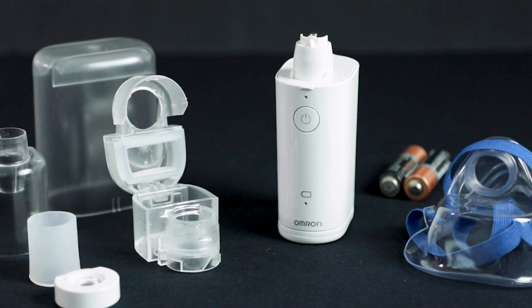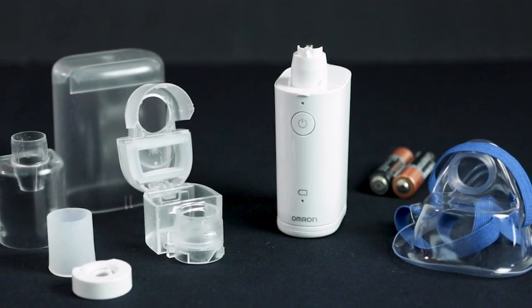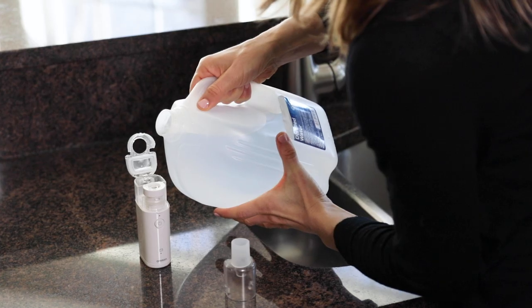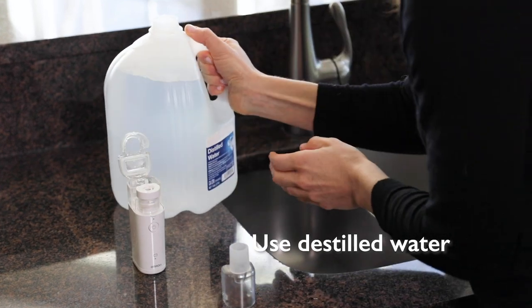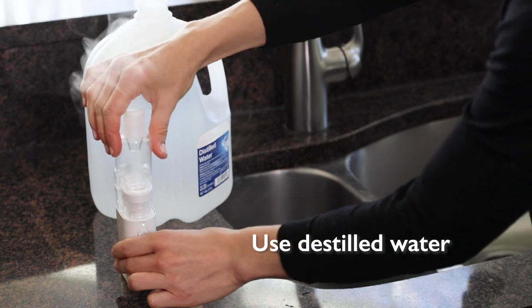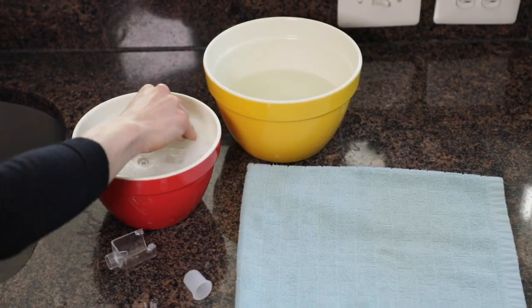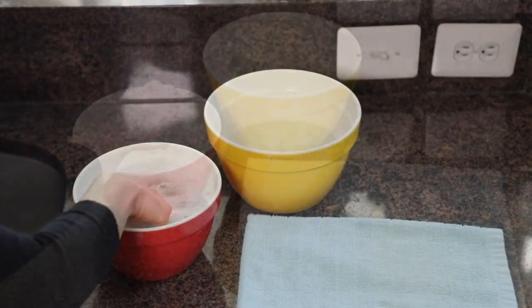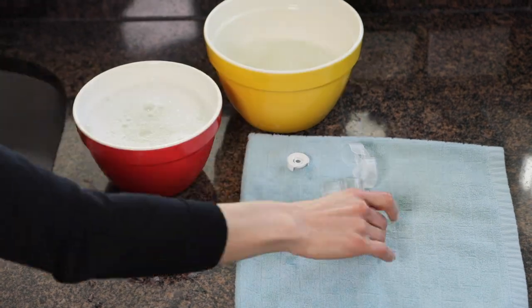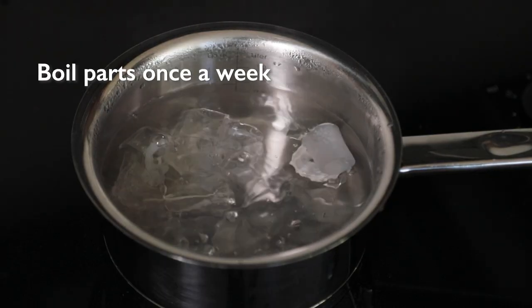All of these units ask that you clean after each use. This one is no different and is only slightly more complicated than the others because there are more overall parts. It is recommended that you run distilled water through the unit after each use, use mild detergent mixed with water to soak the parts daily, and then rinse and dry. Boiling the parts is recommended for disinfecting.